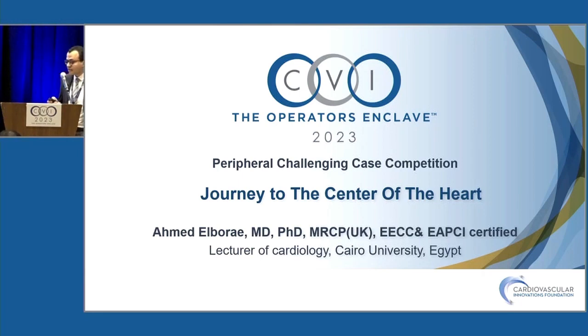So, journey to the center of the heart. The journey of any peripheral, coronary, or even structural intervention starts with gaining access.